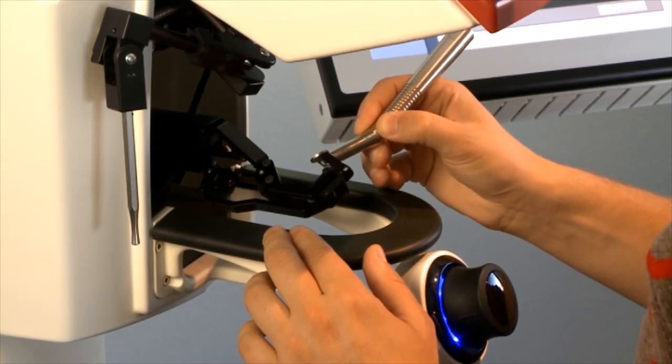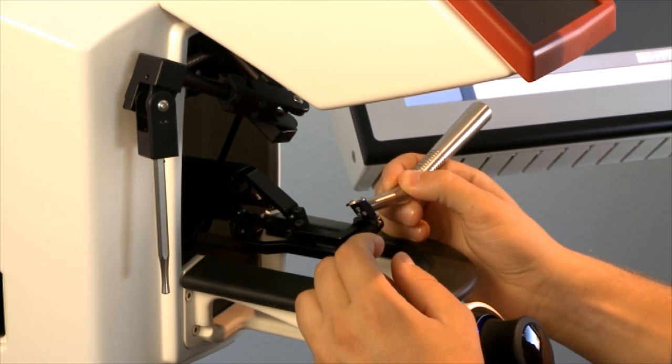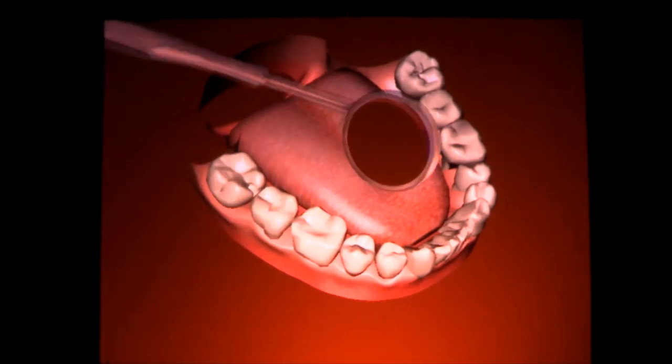Instead of drilling in a plastic tooth, the student can now work in a virtual world complete with three-dimensional images, realistic handling and feel of the drill and the mirror, thanks to the high fidelity force feedback.